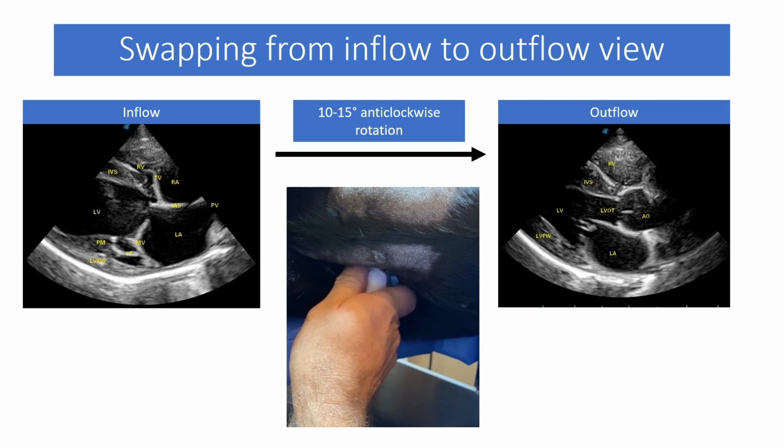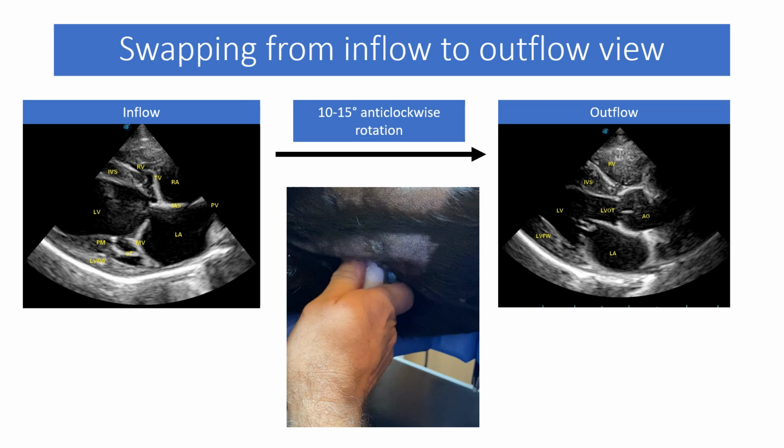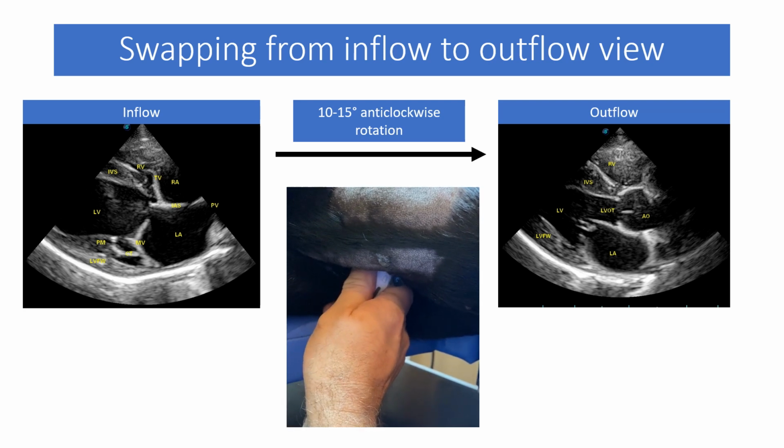Okay, I'll just press play on this video if you have a look. So long axis view, record. Inflow view, and outflow view. So it's a thumb to bum, 10 to 15 degree anti-clockwise rotation. Once again, long axis inflow view and outflow view.